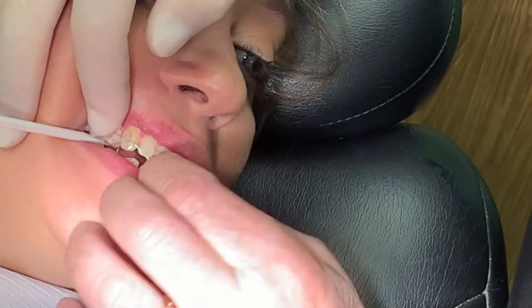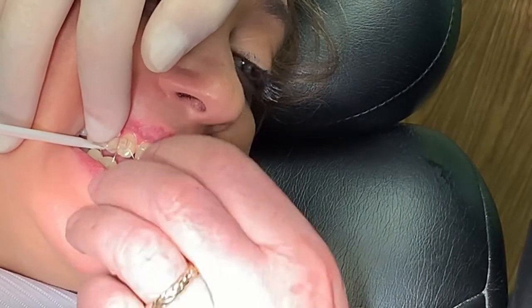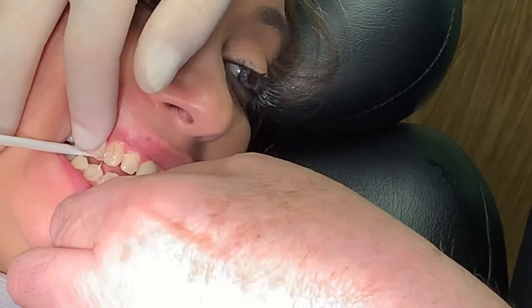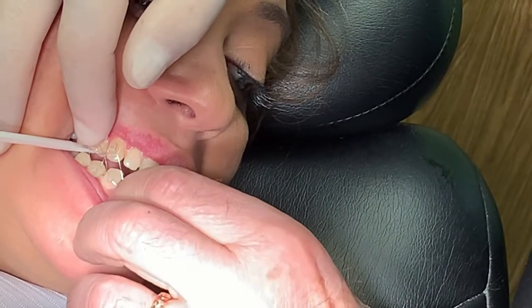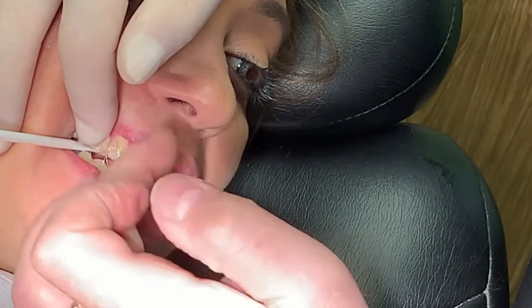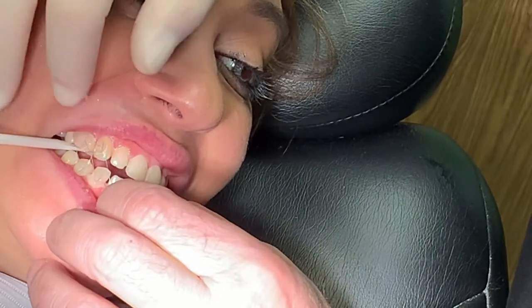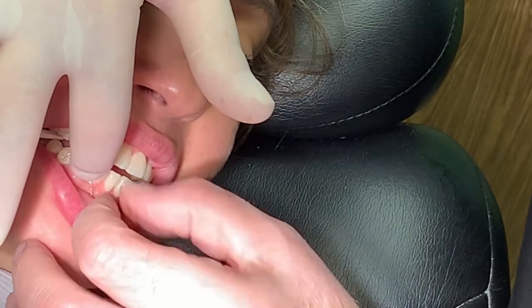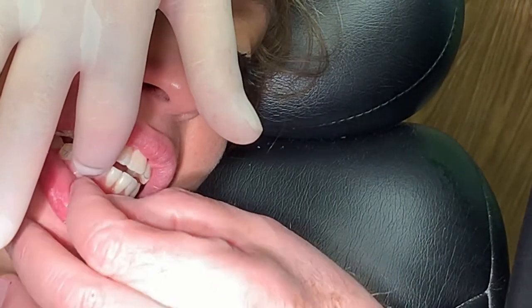and then, now you see that? You see the pattern? Now watch, take the top half, bring it around, put it under, and then see the pattern? See that nice figure eight pattern? Good. Now, you take your twisting instrument, put your finger on here just to hold it, so that you can make, let me show you, because that's what you will do.